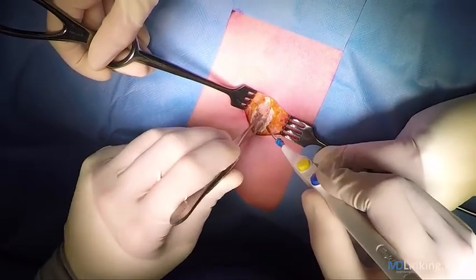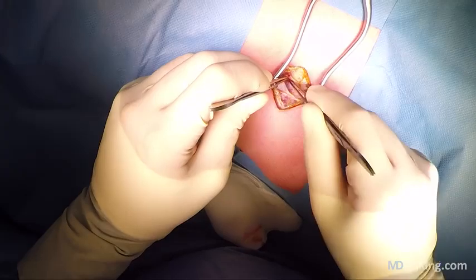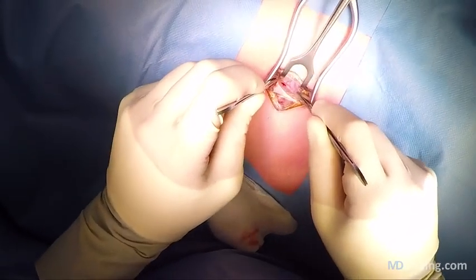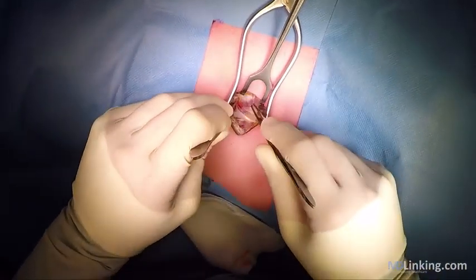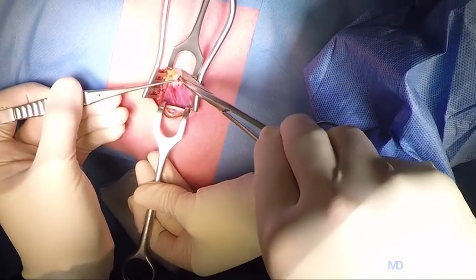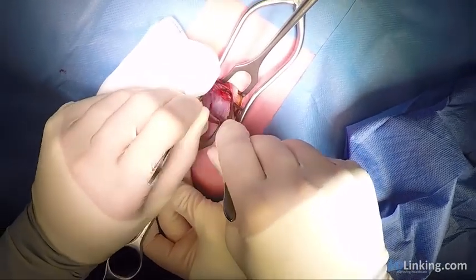Then we come across the aponeurosis of the external oblique muscle, which we open up also. We then proceed with the atraumatic spreading of the muscle fibers, and once we've done that, you'll see the posterior aponeurosis, which is not always present at that point, but that's depending on how far the arcuate line of the rectus sheath extends.